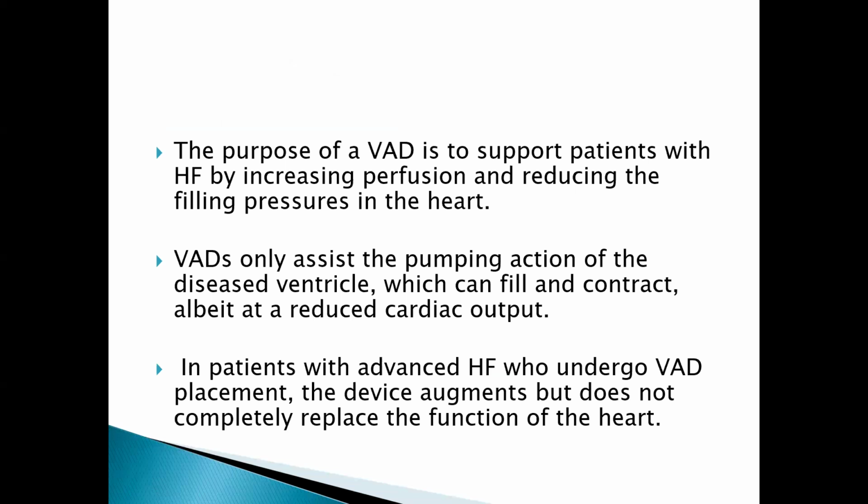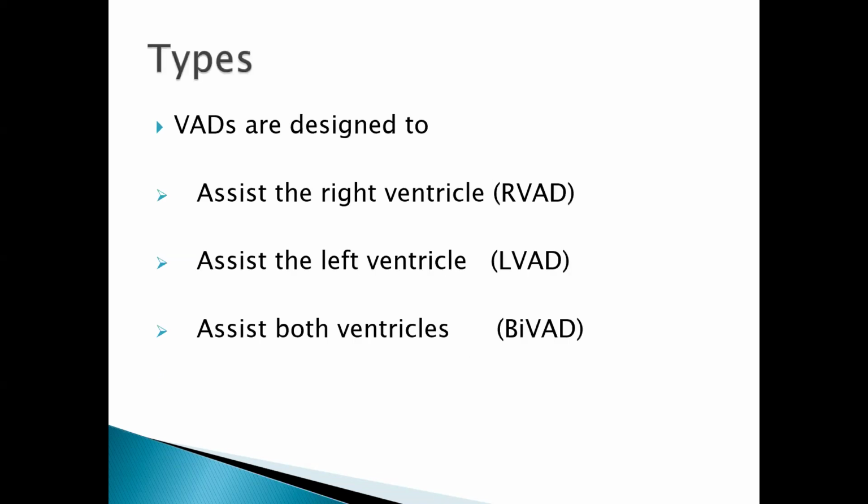Suffice to say that we only use it for patients who have advanced heart failure. When these people undergo ventricular assist device placement, the device itself only augments. It does not completely replace the function of the heart. So these devices are used for augmenting. So what are the types of ventricular assist devices we have?